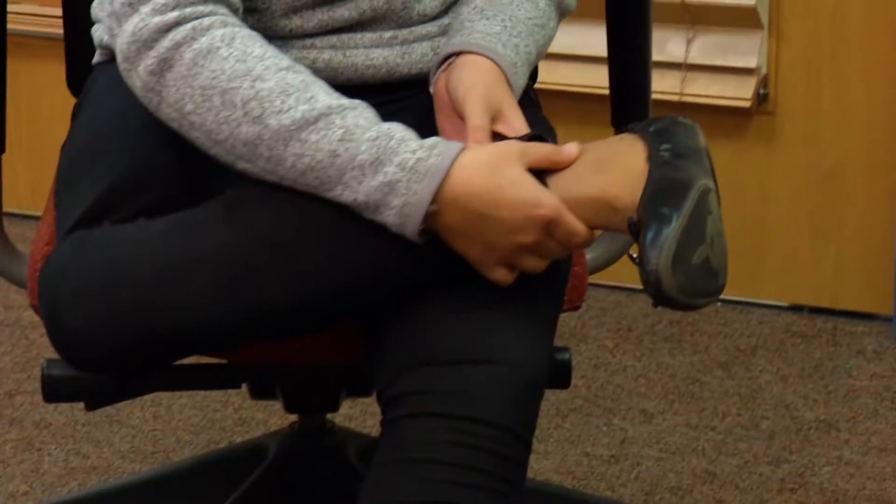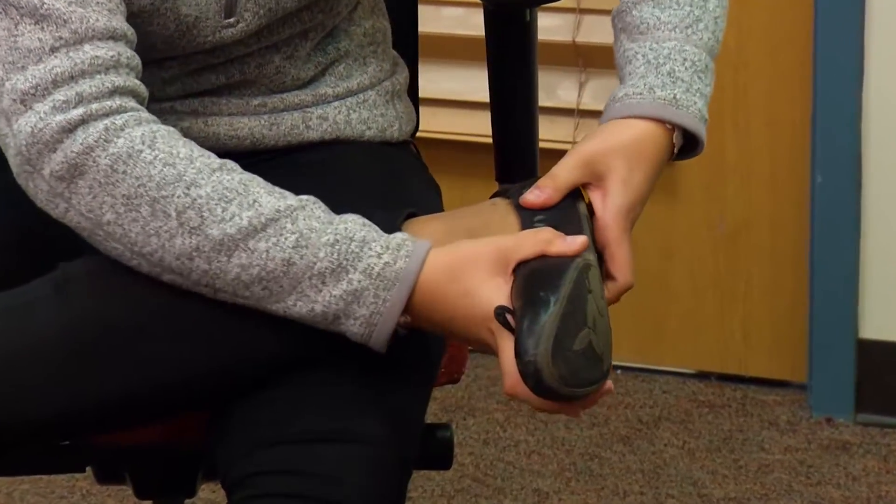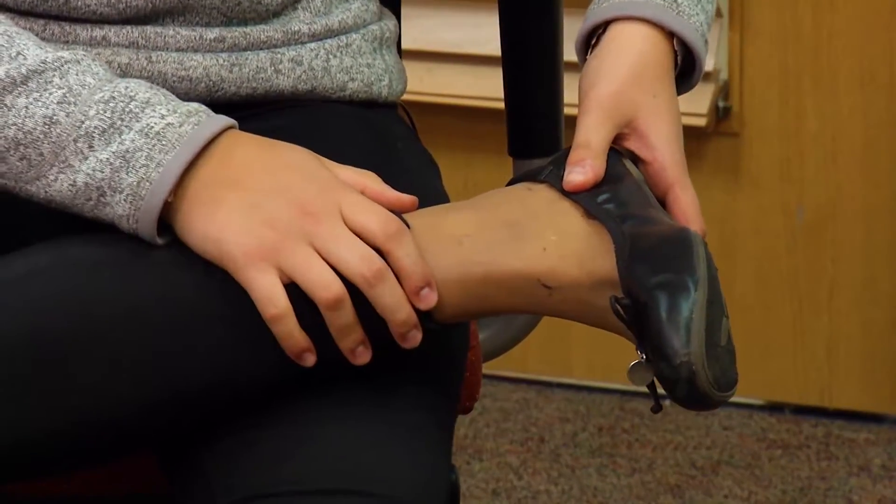Adjusting her prosthetic limb is second nature. There's a button here that I can press, and then my foot can flex this far.